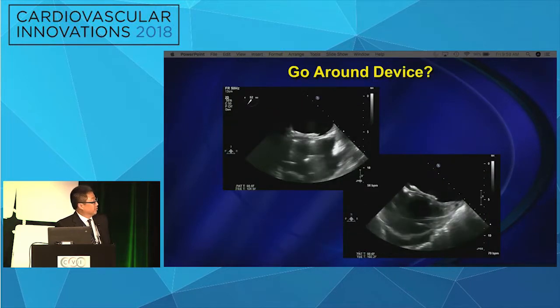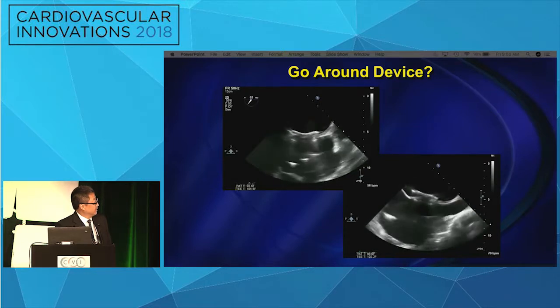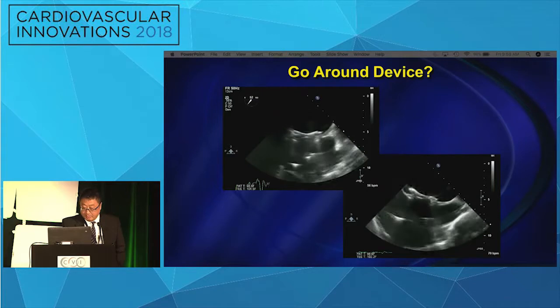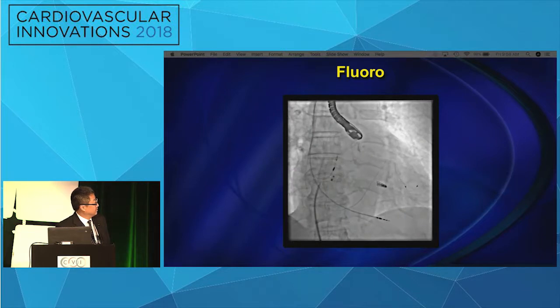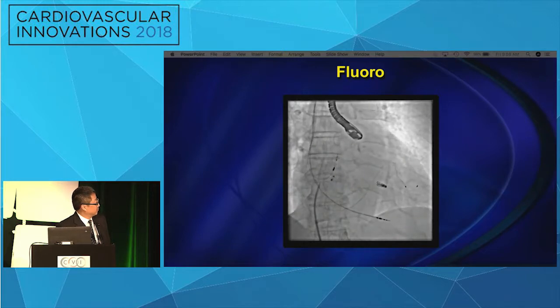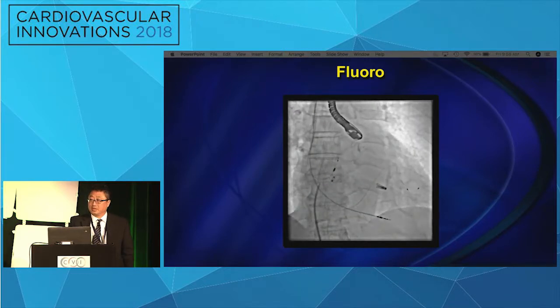One of my junior interventional echo colleagues was doing the case and told me that he could see the needle coming down the SVC and on the superior portion, but then he lost it and couldn't see the needle tenting. He kind of blamed himself. But on fluoro, you have some nice landmarks. You see the clip there, that's where the mitral valve is. You have this ASD occluder device. And Paul's got the needle posterior, just on the edge. But my friend couldn't see the needle tenting. So what would people do? Would anyone go through anyway, based on the fluoro imaging?